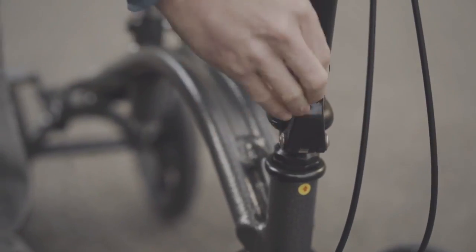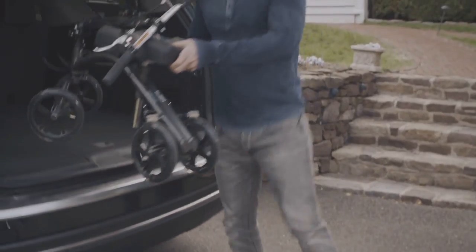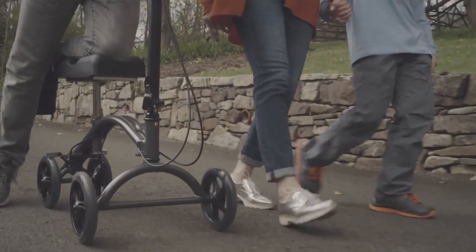The steel frame is sturdy, folds compact, and we can easily pick it up and put it in the car. And look at these wheels — they're smooth, durable, and ideal for indoor and outdoor use.